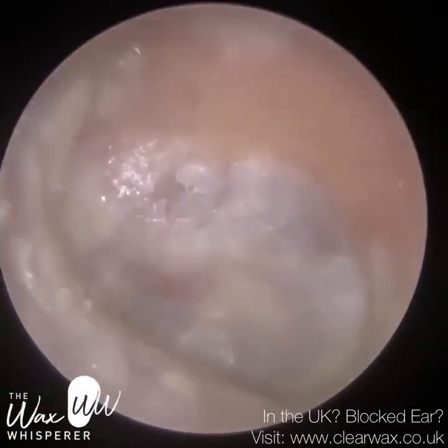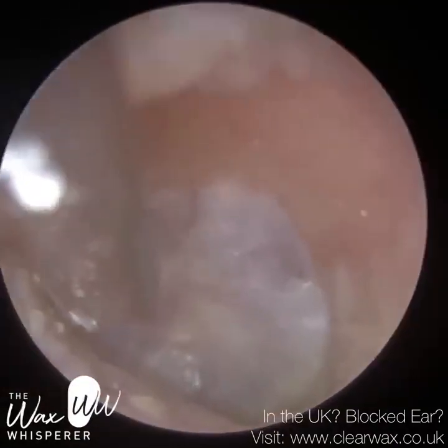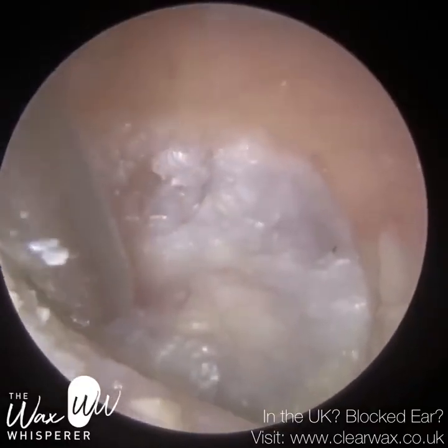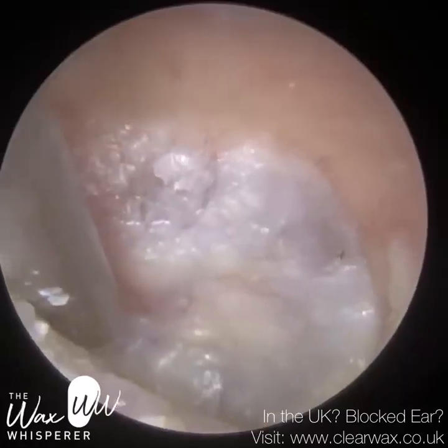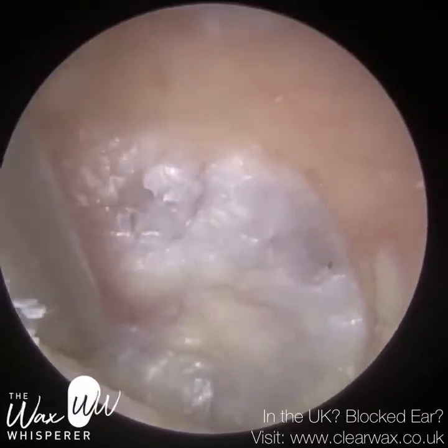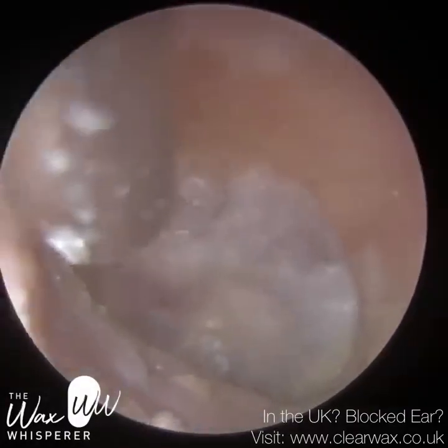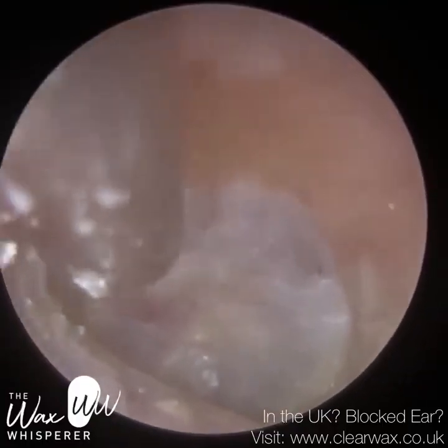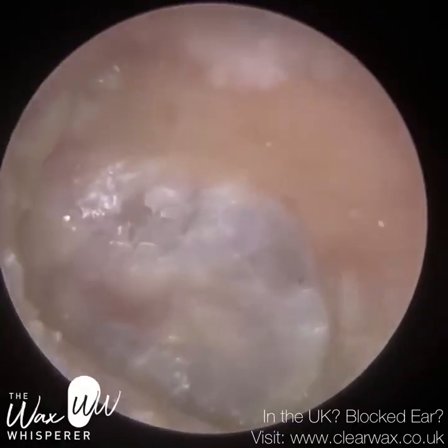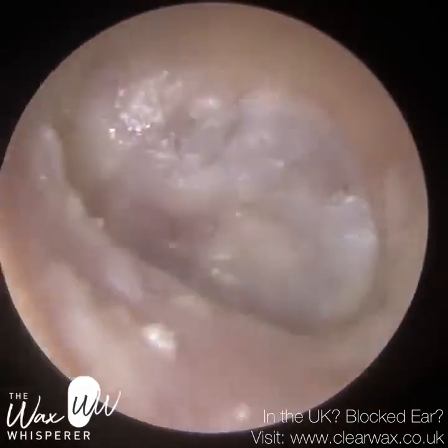So I'm going to now try and get into the anterior recess. I've bent the suction tube ever so slightly. I've got a kink in it, so the kink is moving from right to left, and that enables me to curl around the anterior canal wall. We don't want to make contact with the ear canal to the left. I'm just getting into that blind spot, and you can see the eardrum moves slightly. When I was suctioning, the suction power got a hold of the eardrum, so the eardrum got sucked in, and then when I let go, it sucked back out. So it tells me to leave that area now.